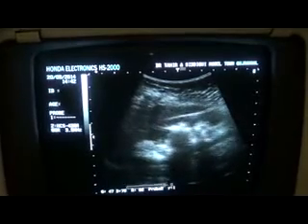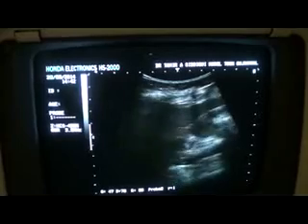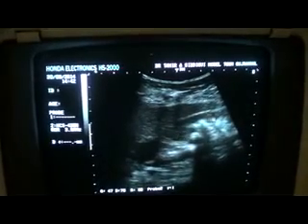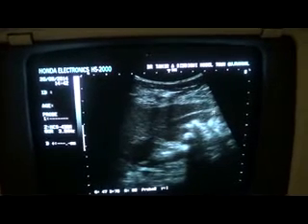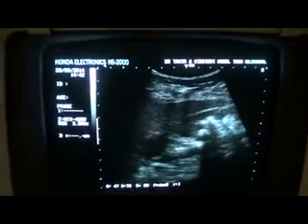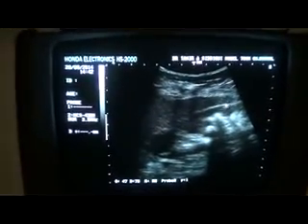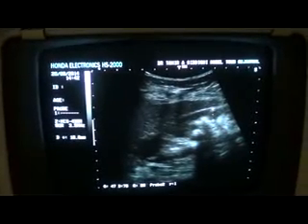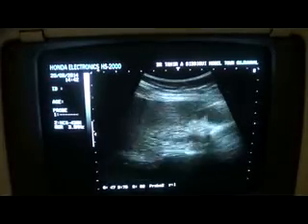As you see, at the anterior mid region, this small cystic area is the pyramid, the upper area is the cortex, and the parenchyma in this region measures approximately 10.6 millimeters and is preserved.